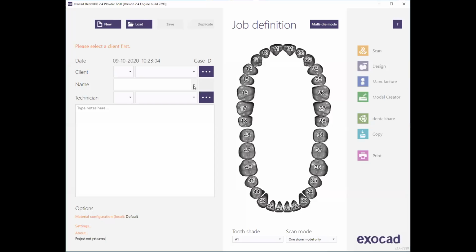So we begin. Yes, please. With your kind permission, we may start. Okay, thank you. So we are at the order stage, and the scan data which I'm going to use, normally we scan and then switch to CAD designing. So we will first see the model. When we scan, then we have all this information available. So we just test the model and we open the Exo viewer.